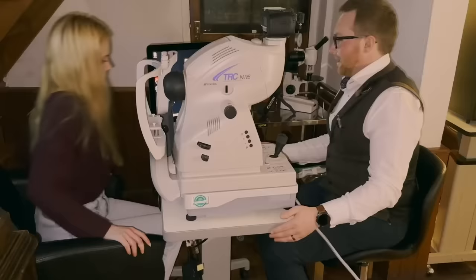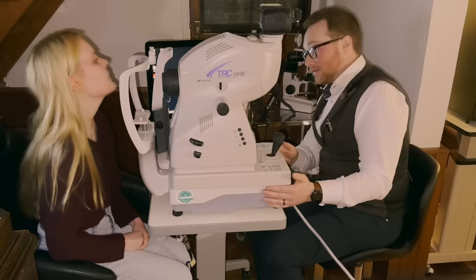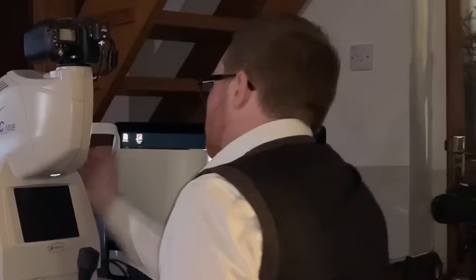Let me just bring the table. Right, so we'll start with this one to your right. Let's bring the table up a little bit. And it always helps if I take the lens cap off, for a nice clear image. So what we're going to be doing is getting a photograph of the back of your eye. And then we'll use the scanning laser ophthalmoscope just to get a detailed view of the layers of your eye. So I'm going to get you to pop your chin on the chin rest.